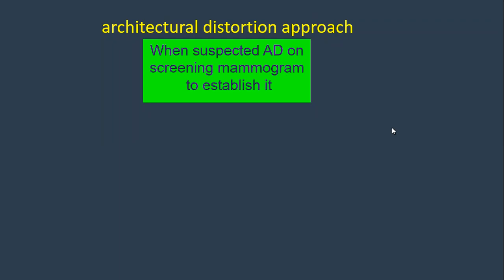When you bring the patient back and do further images, which mammogram do you call it? Which setting? We said before we have two settings: screening as well as diagnostic.